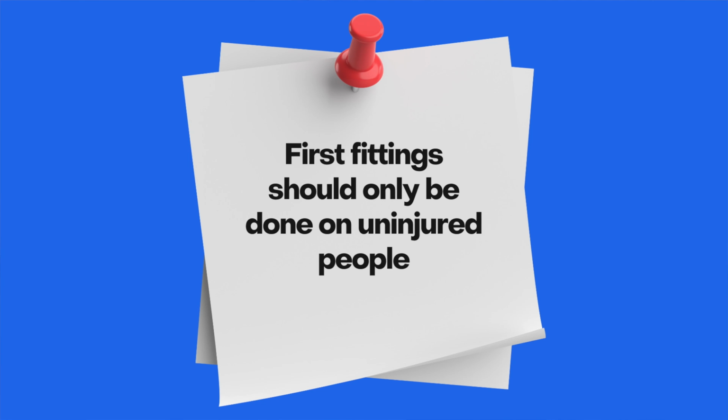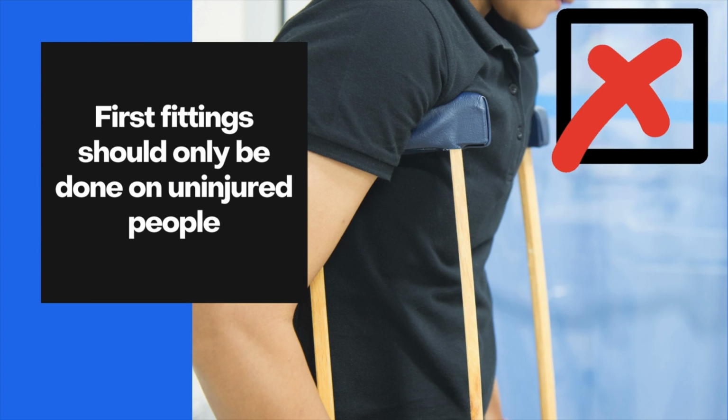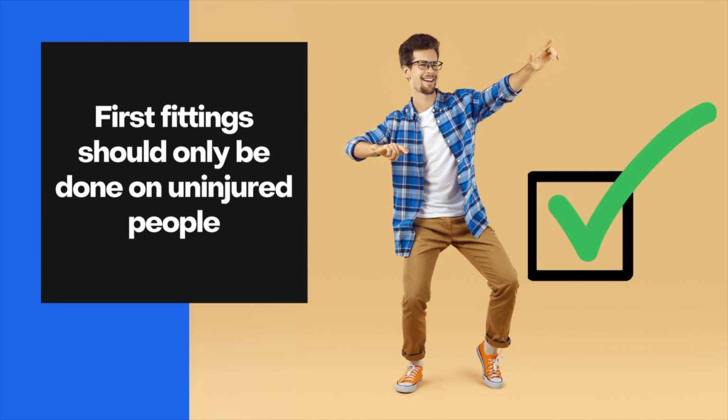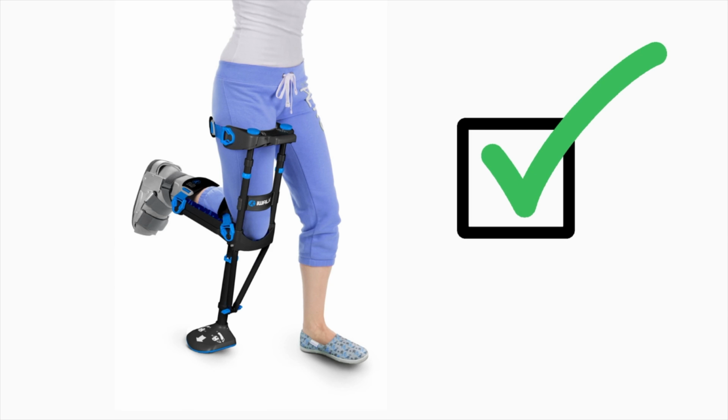Here are some essential elements. Please note, first fittings must be on uninjured people. Fitting actual injured patients or customers should not be attempted until certification is complete. Avoid dark clothing, as it blends in with the black iWALK crutch, making it difficult for our technicians to assess the relationship between the crutch and the user's leg.